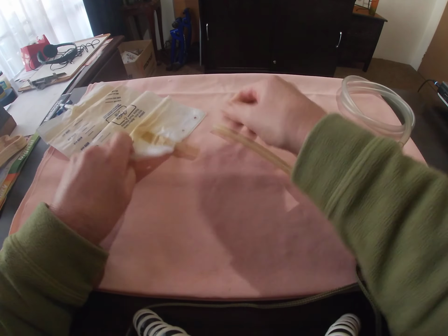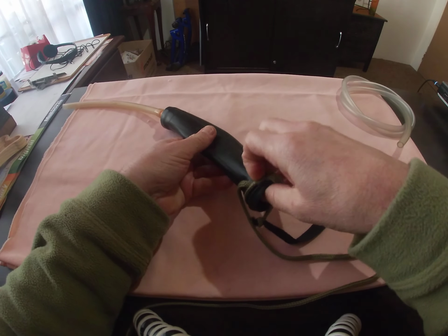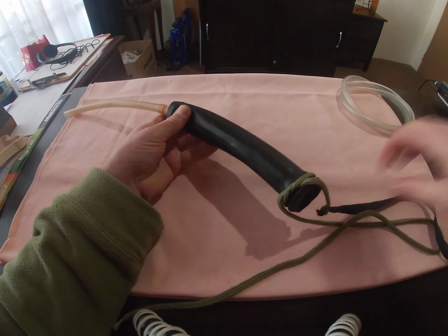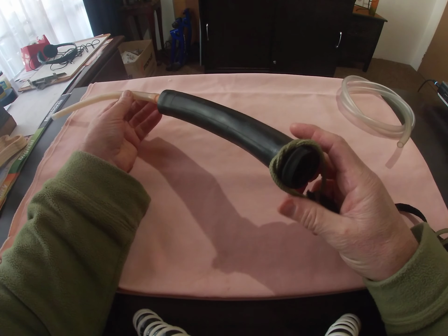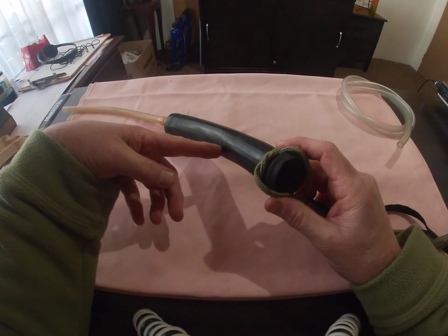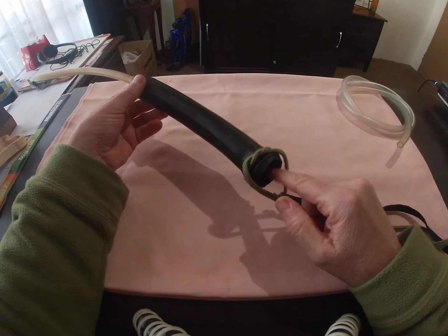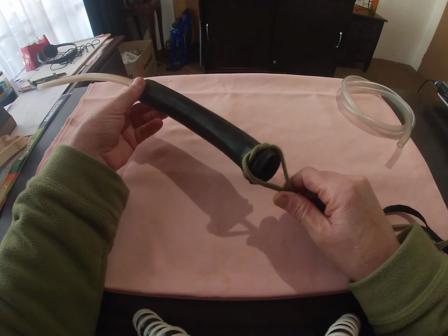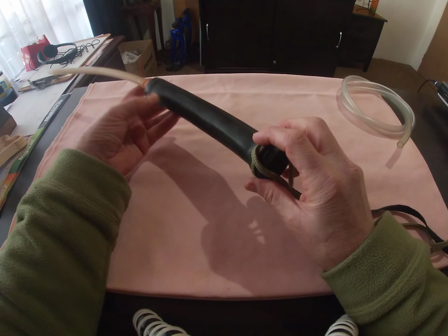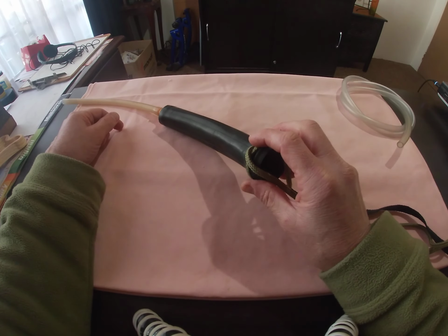I think the most important part of this is that this is kept, because obviously you cannot go and do handstands and that. Not that you're going to do it, but you want to keep this angle, because with the internal catheter the work is done, but with this, if you leak, it's going to come out here, and if it runs back, I never had this problem actually, it will come out here. But I found that if I did that, I never had any leaks. So the concept works very well. It keeps a good seal. But if you can keep the angle of this at least like that, I thought this worked great.